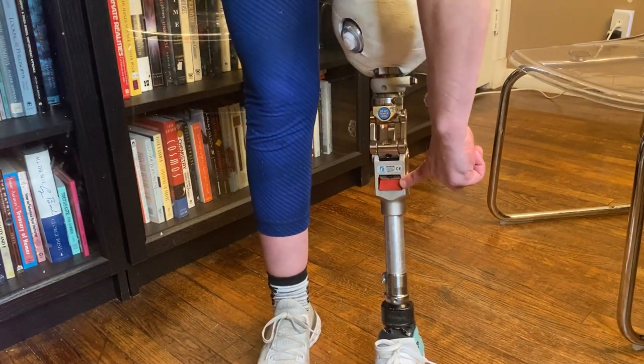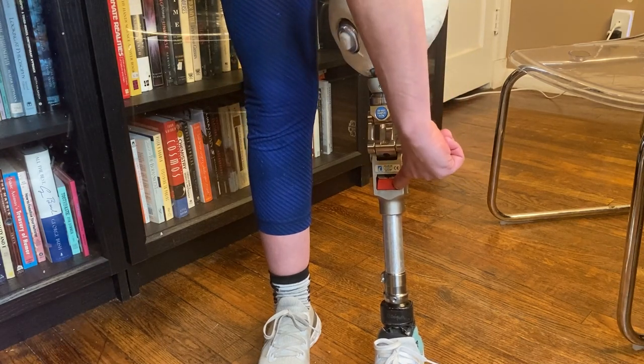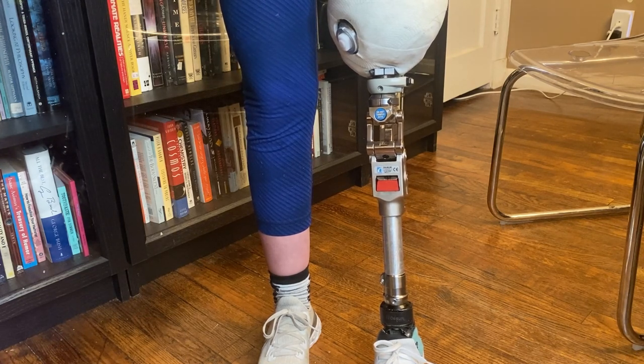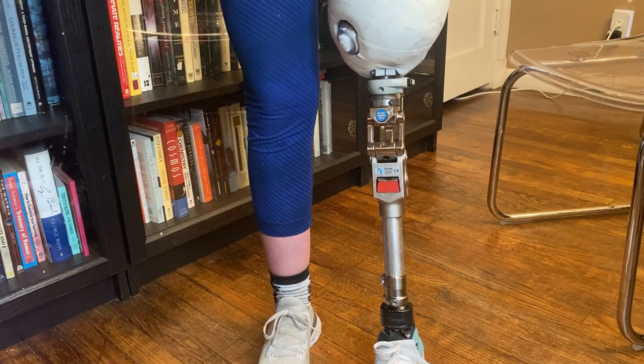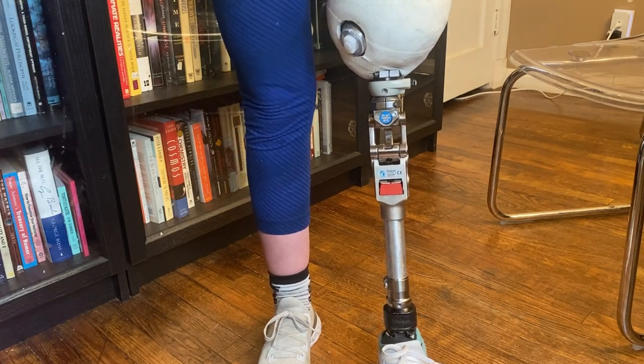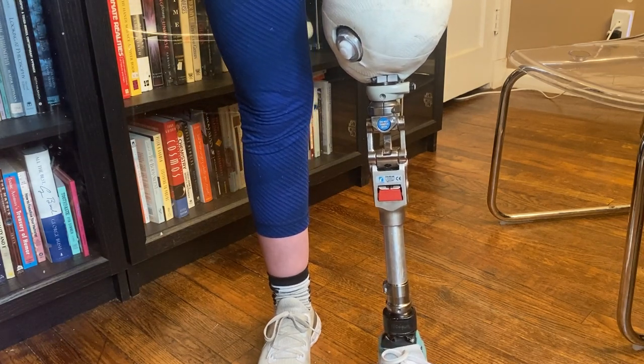This red thing you see here is a bumper. They come in different stiffnesses. This one is actually too stiff for me — I'm supposed to have a black one. I know that because I looked in the manual for it, but it's a knee that I'm borrowing. So it's not that big a deal. It's not set up perfectly for me, but that's okay because it's just something I'm borrowing and not going to be using forever.